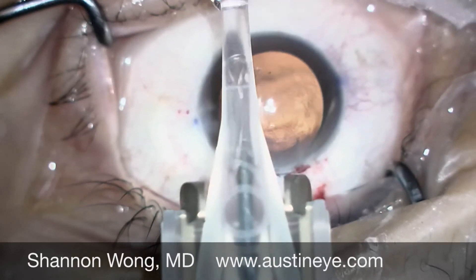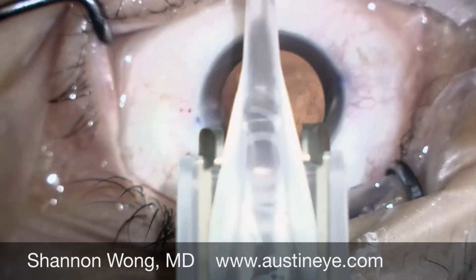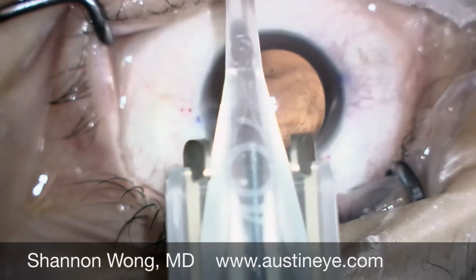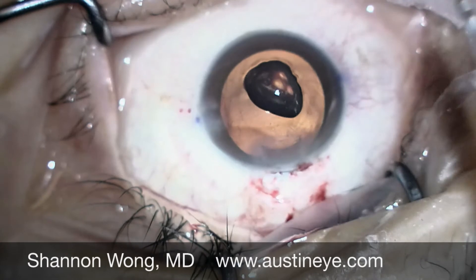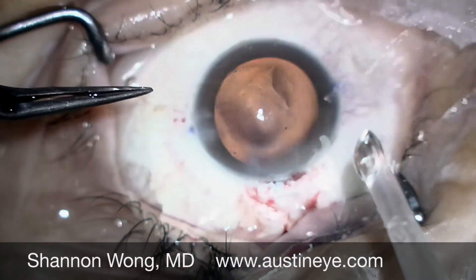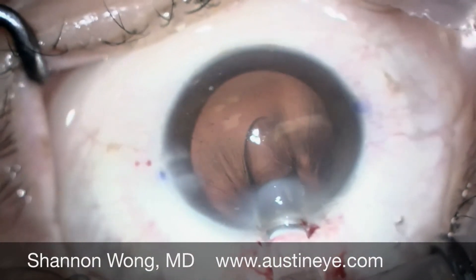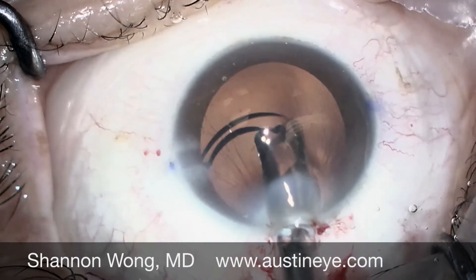So we back out and kind of double clutch, and then make sure that the trailing haptic is captured by the grooved tip of the inserter. Because the entire trailing haptic is now in front of the tip, it is very unlikely that the trailing haptic will become incarcerated into the tip of the insertion cartridge.